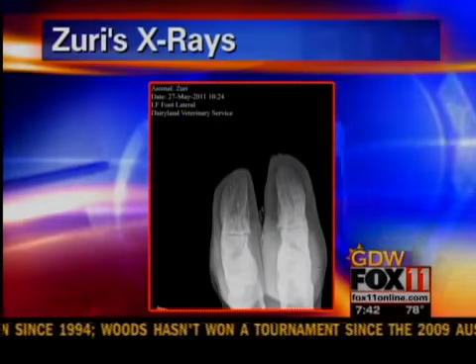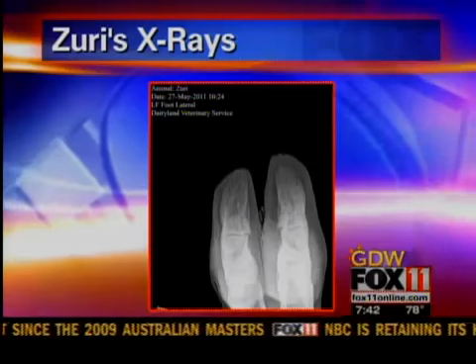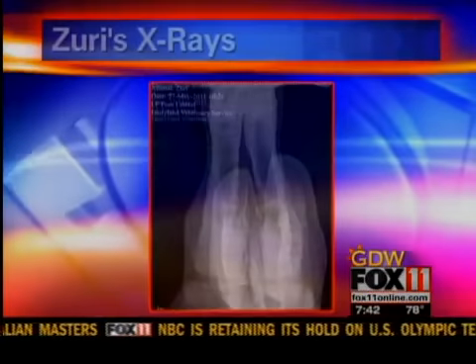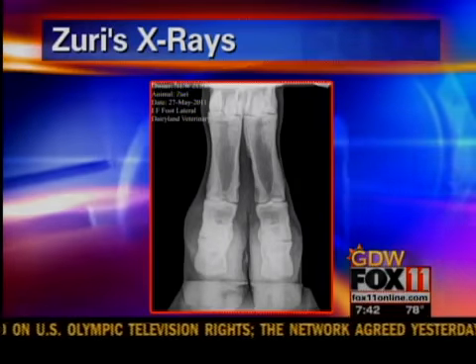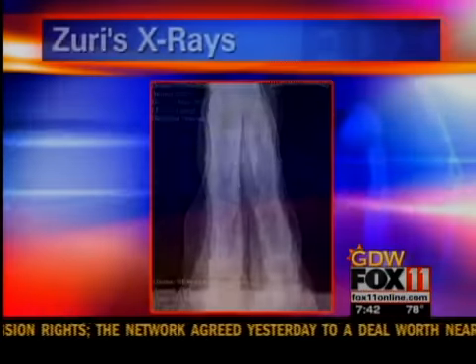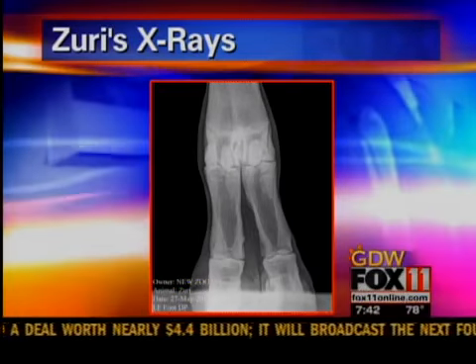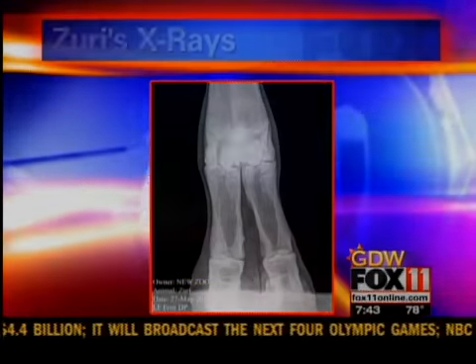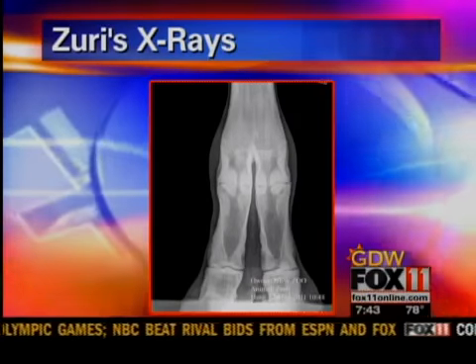And so we're showing you on the screen just some of the images that we were able to take a look at. So when we're looking at these X-ray images, the one thing we are looking at is, is there an infection or not? And is there a fracture or not? Or is there something else going on? So we looked and looked, and everything looks pretty good. There isn't any infection or anything. But the great thing is we're able to get an X-ray like this, safe and sound, and be able to take a look at it.